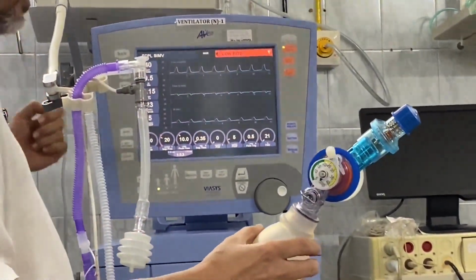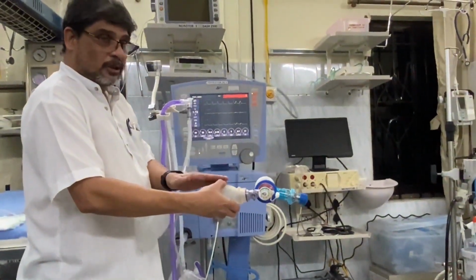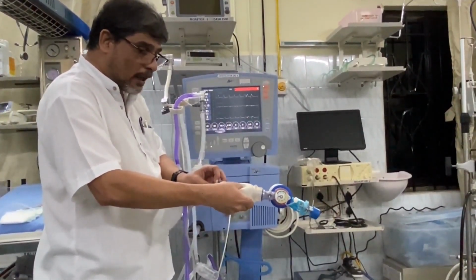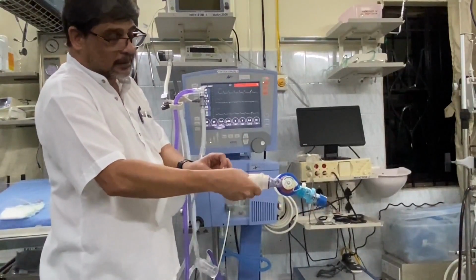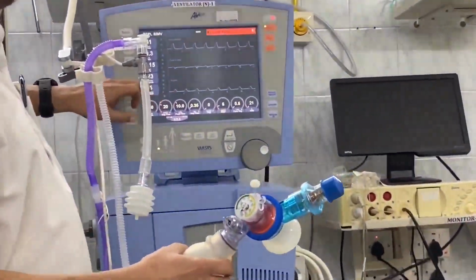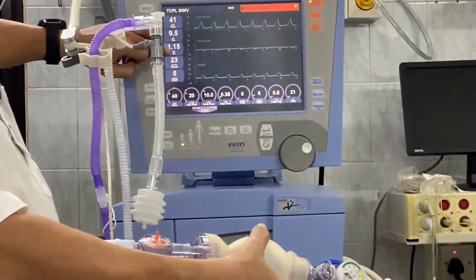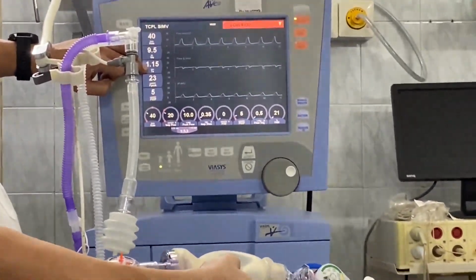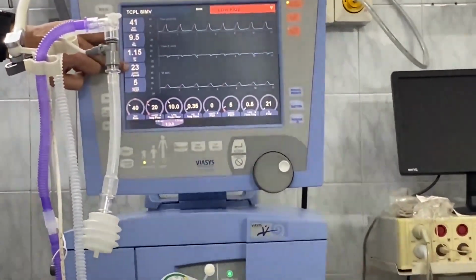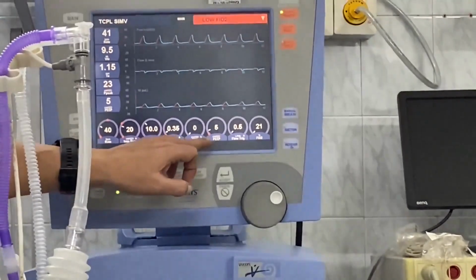You can see the inspiratory pressure. At the end, if you release this totally, you get a positive end-expiratory pressure which is 0. If you give inspiratory pressure and don't allow the thing to go to 0, and keep it pressed like this till you give the next breath, that is known as positive end-expiratory pressure, that is known as PEEP. So you are not allowing the thing to fully go back to 0, but you are keeping some amount of pressure at the end of expiration. So you do the settings of PIP and PEEP.